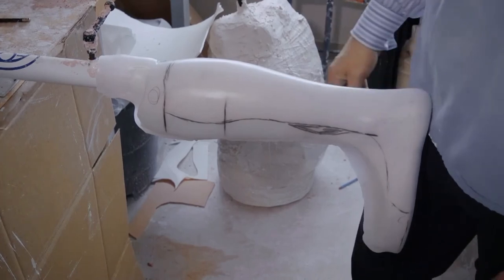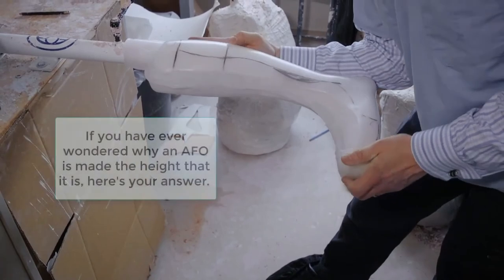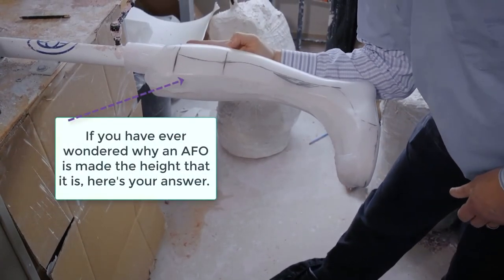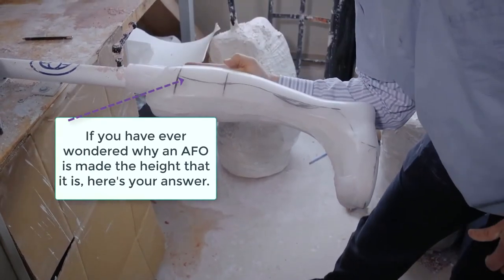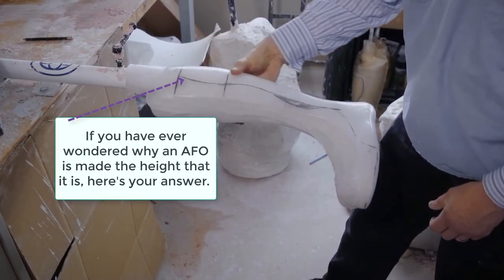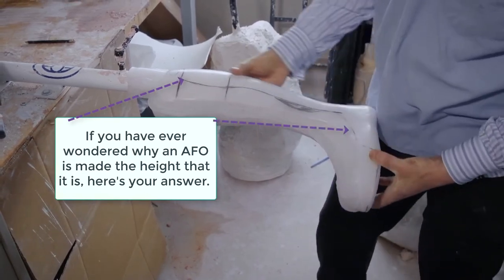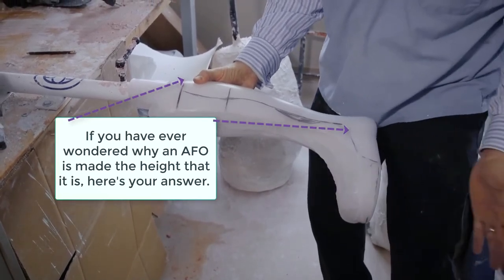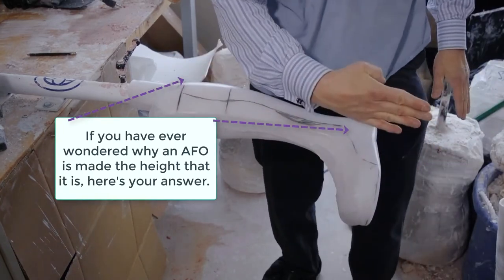If a person snaps their knee back, if you can imagine a lever arm coming all the way up here, trying to do what it can to hold the leg straight so the knee that would be right here doesn't snap back. So we're trying to hold onto the bone like that. Another reason why is we need all of this to offset what's going to be happening here. It's kind of like a lever in a sense. And we're trying to offset this foot from dragging down.